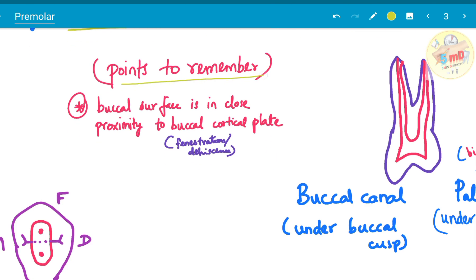The other point to remember is the buccal surface is in close approximation with the buccal cortical plate. Therefore, there is higher chance of fenestration or dehiscence while looking for the canal. If you move like this, there could be a chance that you could perforate the buccal cortical plate. Therefore, keep it in mind.